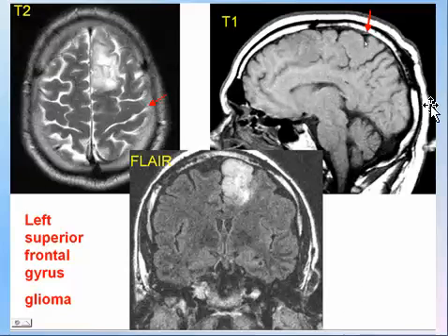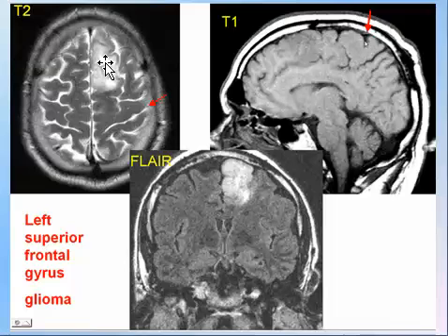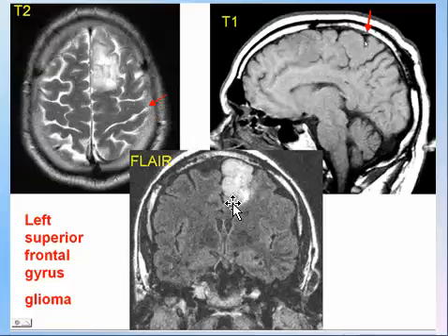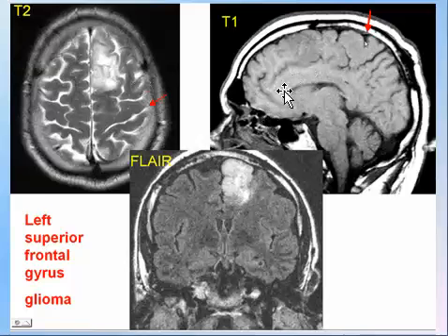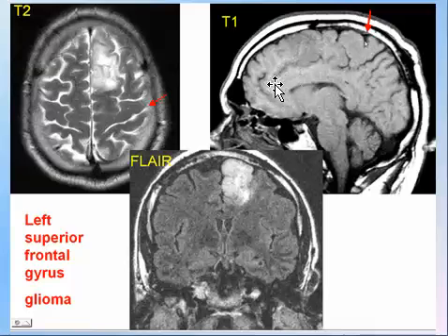Another lesion can be identified in the superior frontal gyrus — this is a superior frontal gyrus glioma. The most inferior part medially constitutes the cingulate gyrus, and this is the cingulate sulcus.